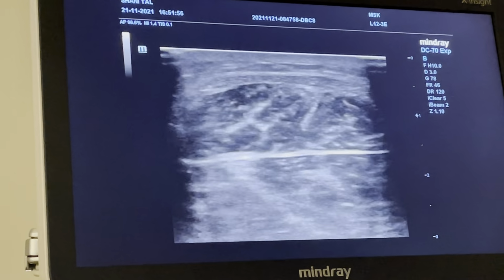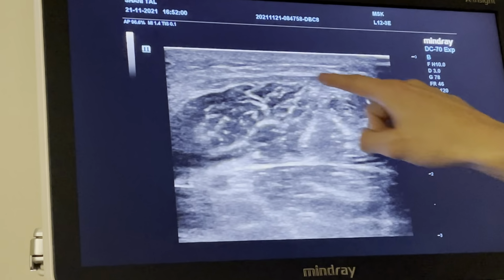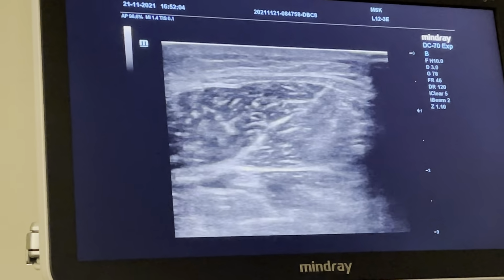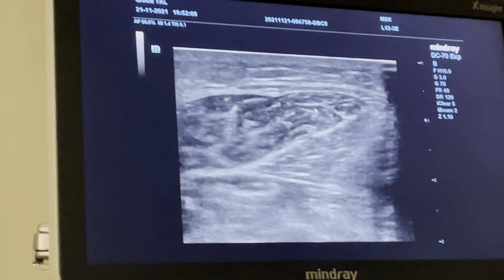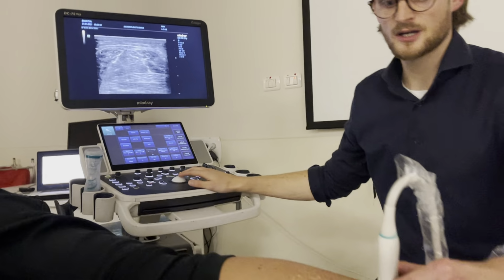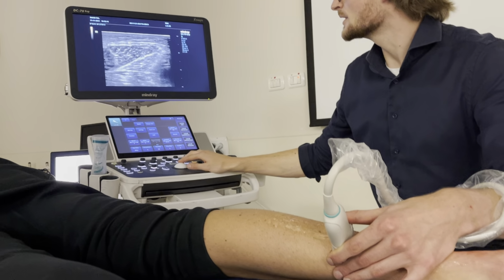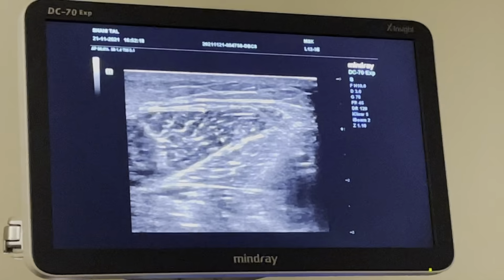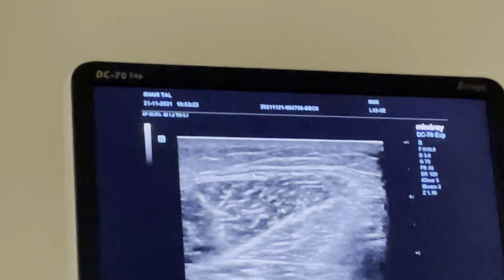Okay, we move up once more. Okay, this is Achilles tendon. It's actually more an aponeurosis. This is soleus muscle. This is flexor hallucis longus. I'm moving a little bit to the medial part of the lower leg. So I was here, and I'm going now to here, and focus on the aponeurosis of the Achilles tendon. And I see here a little structure. This little structure over here, that will become the plantaris tendon.